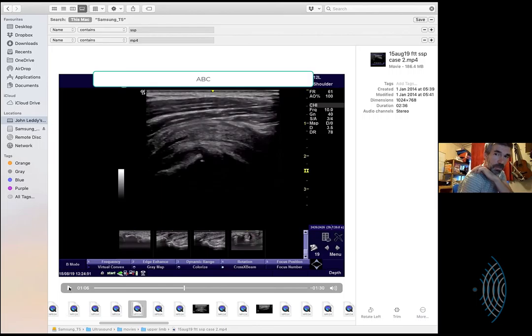When I scan these structures, what's running in the background? When I scan supraspinatus and infraspinatus, what I have in my head is, you know when you palpate the supraspinatus fossa all the way back to the back, that's my orientation point. Meaning that's where you aim to be, to the actual vector line of the muscle.